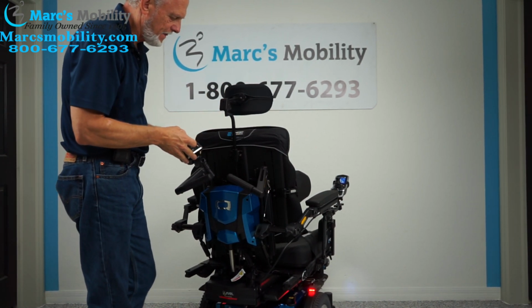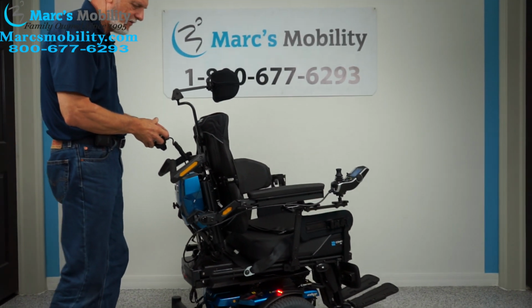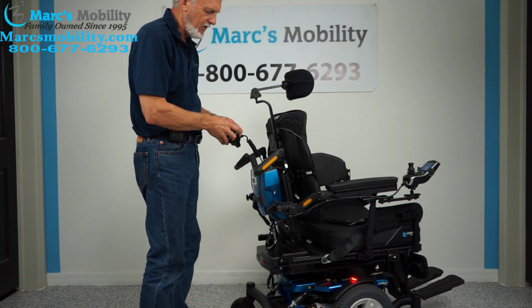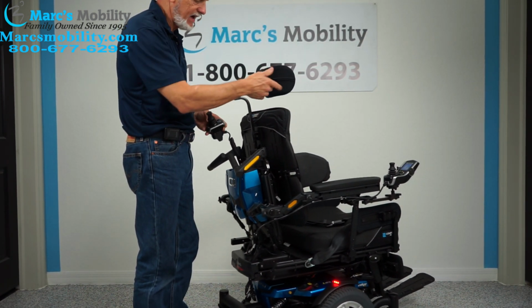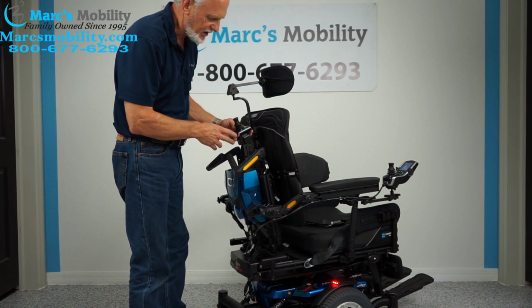And now I can drive the chair right from here. So whatever you can do in front, I can do back here with this joystick. So this is called an attendant control. It's on this chair already.